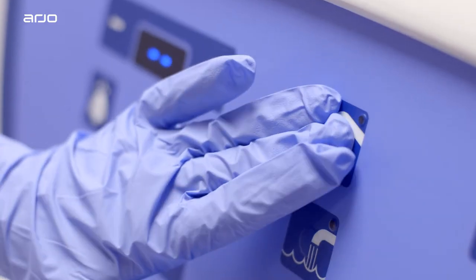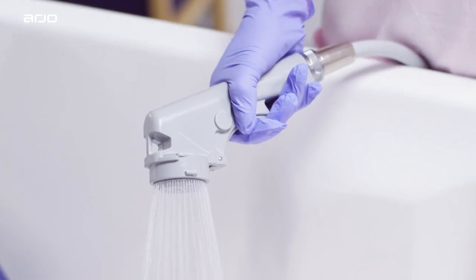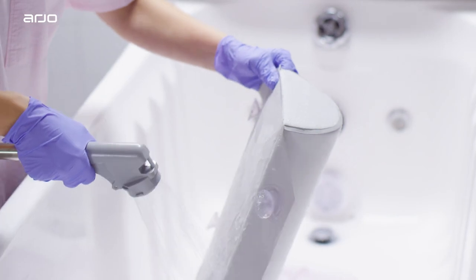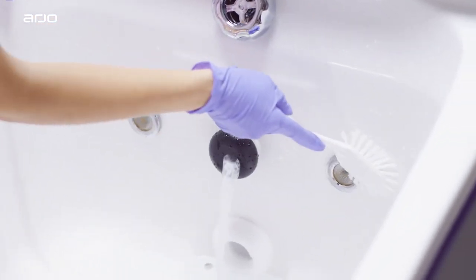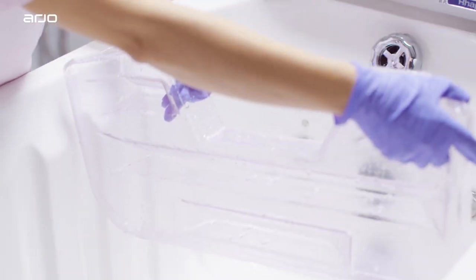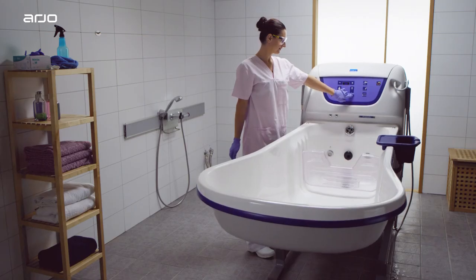Always use protective glasses and gloves. If contact to the eyes or skin occurs, rinse with plenty of water. If eyes or skin become irritated, contact a physician. You should always read the safety data sheet of the disinfectant before starting the routine. For optimal performance, use only Arjo disinfectants.